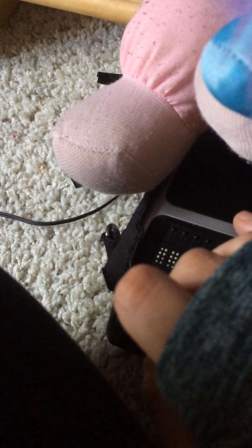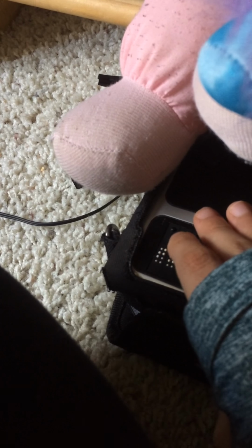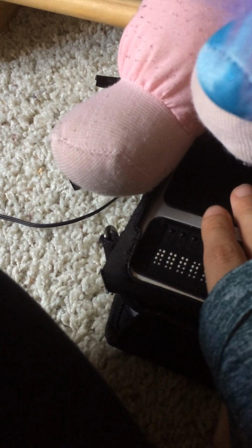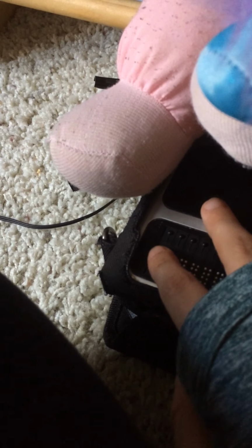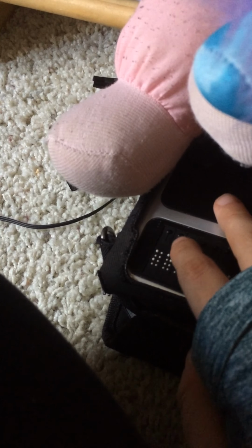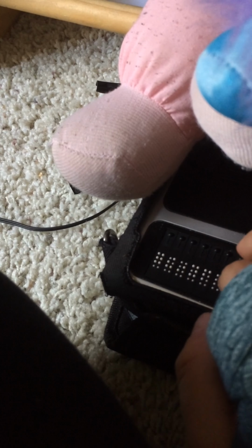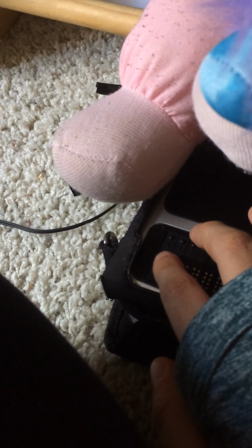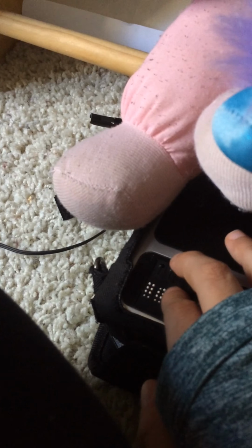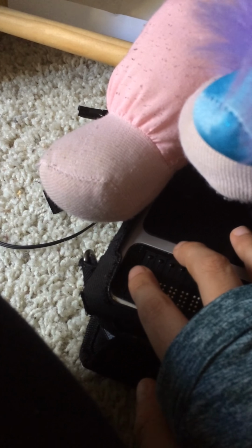Terminal for screen reader. Now this is where you can connect this Apex. You can also use it as a braille display, which is really cool. Keyboard learn. You can learn the keyboard on your Apex this way. For information, press space with I. Information about your Apex. For the options menu, press space with O anywhere. The options menu will show your options in your settings. End of menu. And that's the end of the menu.